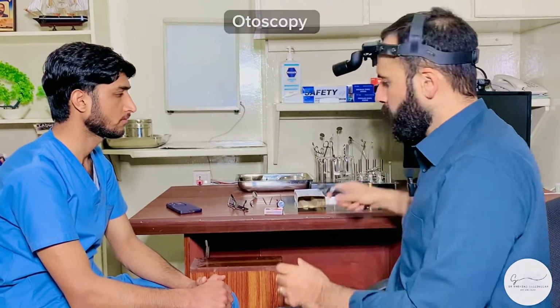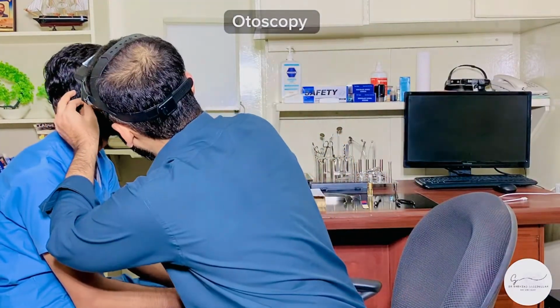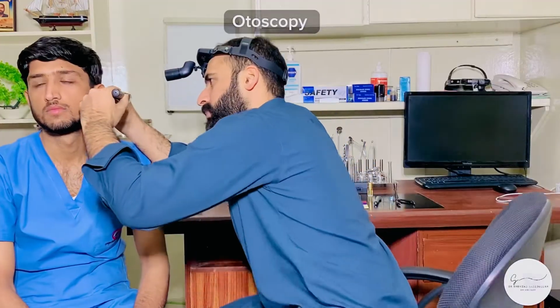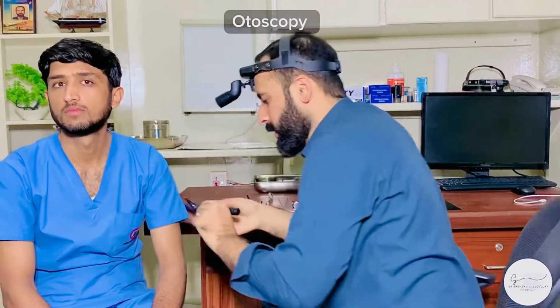The last step in examination of nose for the postgrads is otoscopy. So we will take an otoscope, turn it on and have a look inside the ears to look whether the tympanic membrane is retracted. दूसरी तरफ मुड़ें. In the same way, we are going to have a look at the left ear. So this concludes our examination of nose.